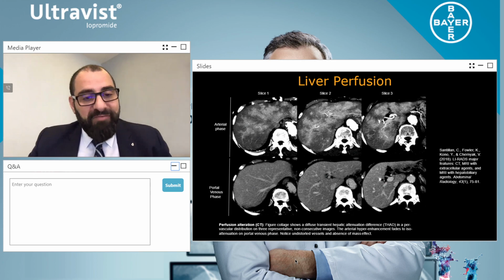Now remember, everybody, each contrast manufacturer has a different viscosity profile. And if I'm only talking about the evidence that is actually seen in the FDA, as well as the American College of Radiology, the Chinese Radiological Association, as well as the European Society of Urogenital Radiology, this is all based on viscosity.